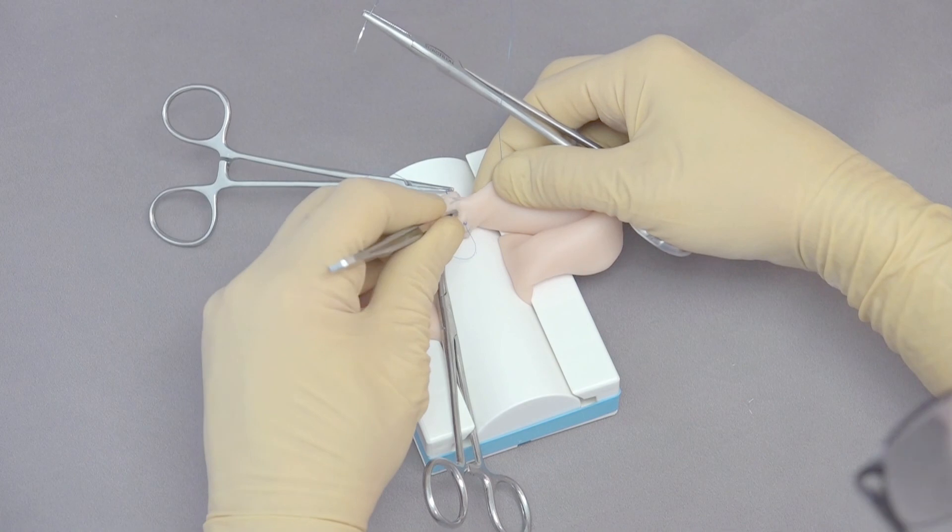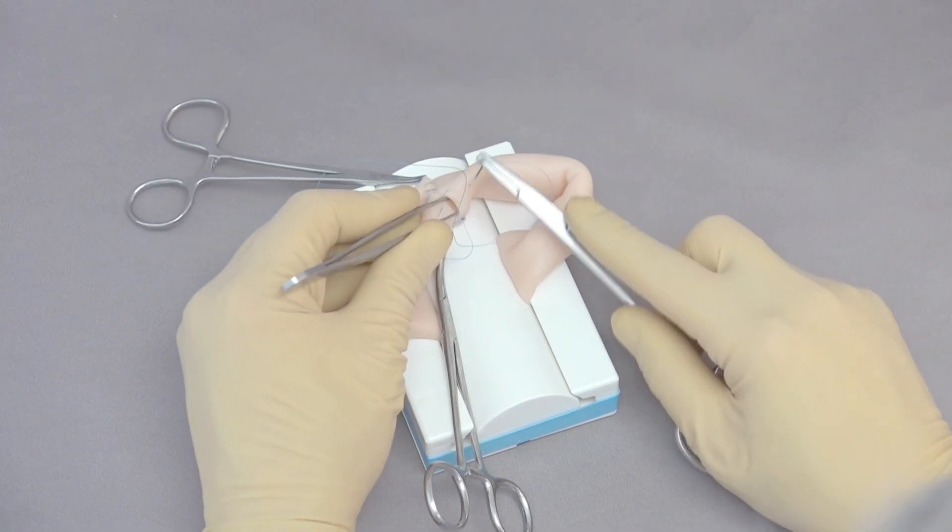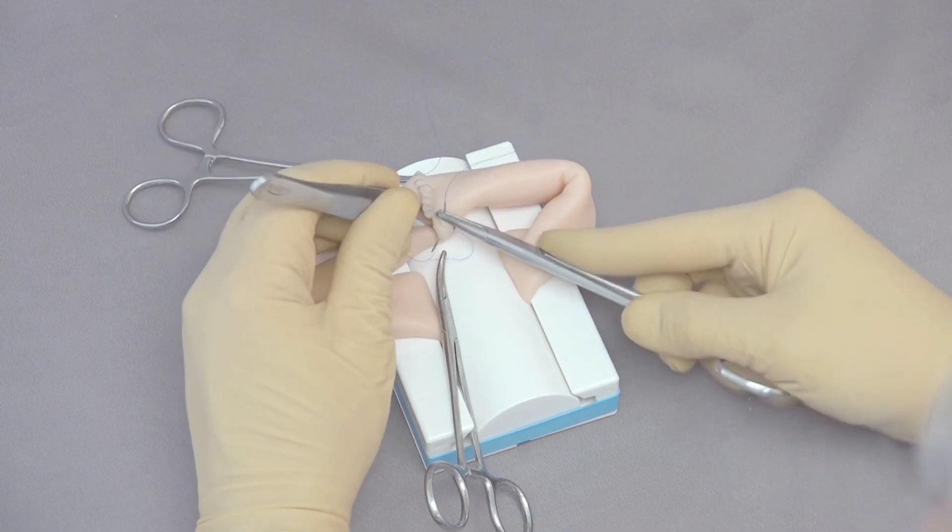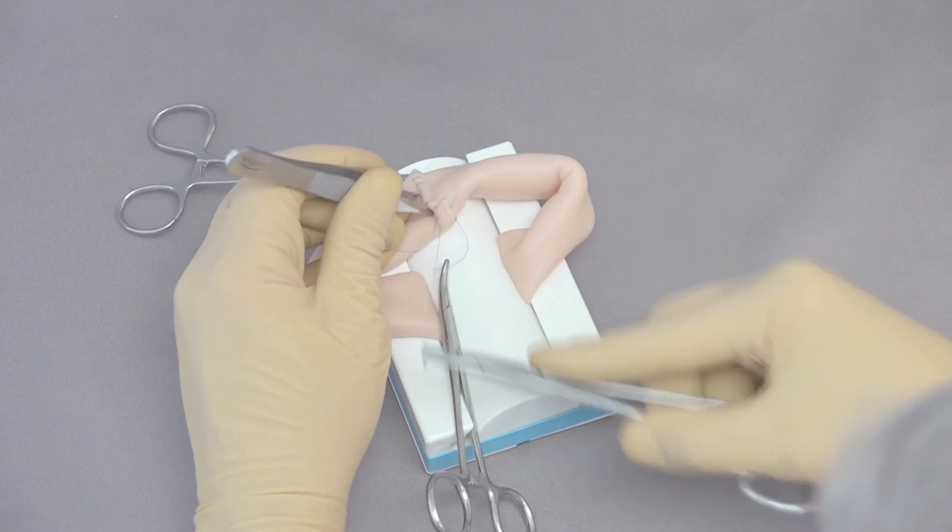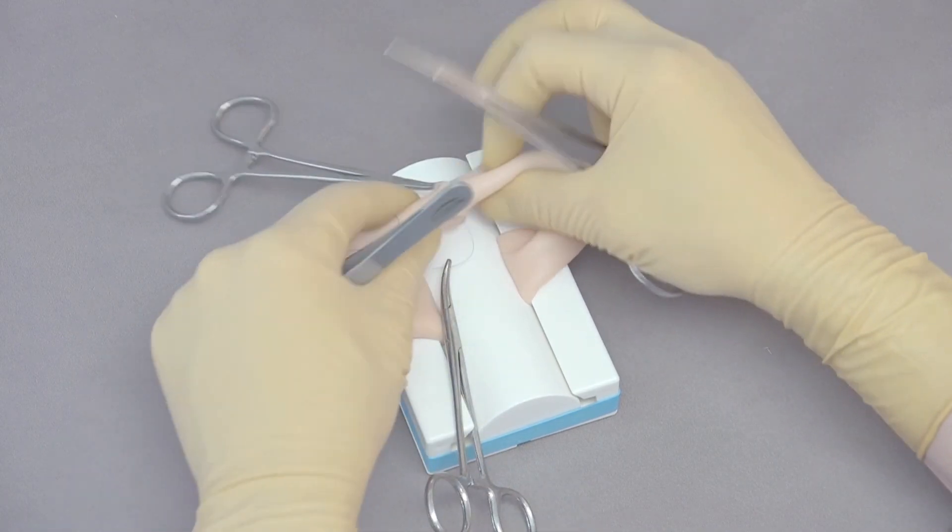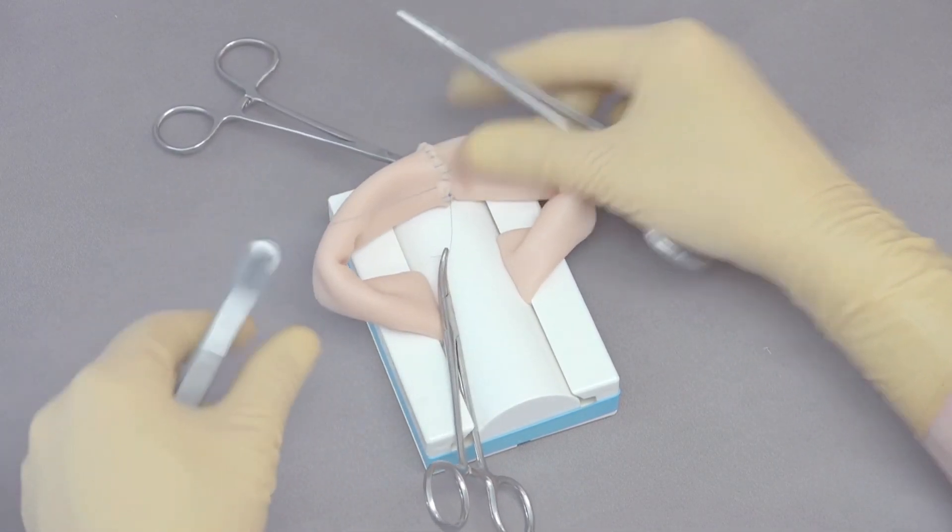And again we've got this last one, I get the thumb forceps just in the middle, making sure that I'm not going all the way across to the opposite side of the intestine. I'm going to pull that through here and now you can see I've got my closure complete.